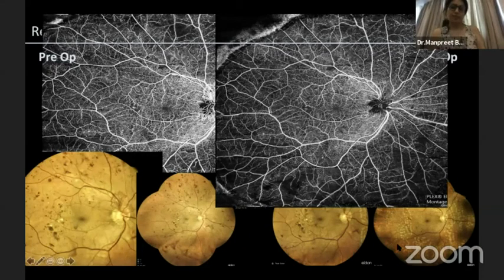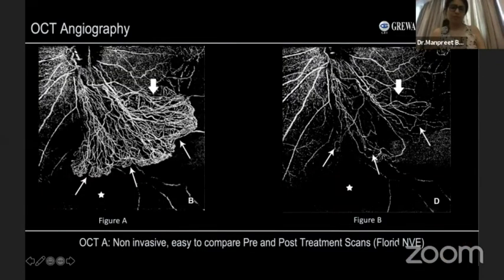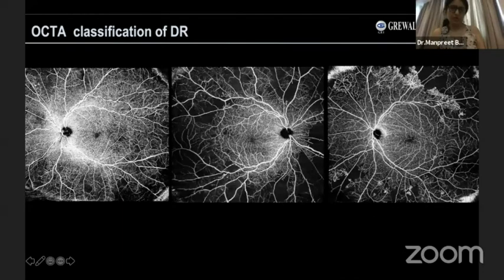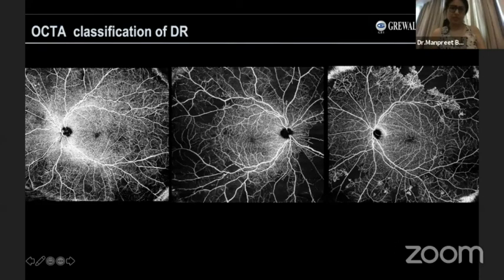This is something the field is heading towards — classifying different stages using OCTA montages. The first picture is of moderate NPDR, the second of severe NPDR where you see a lot of non-perfusion but no clear-cut NVEs or NVD, and the last picture is of a PDR with florid NVEs easily identified on the OCTA.